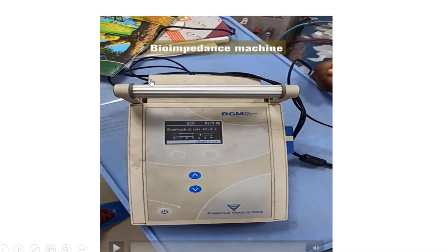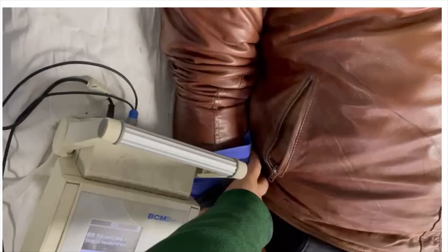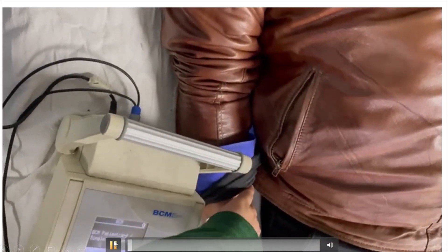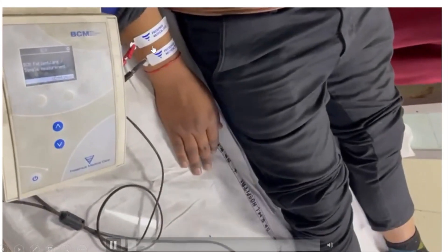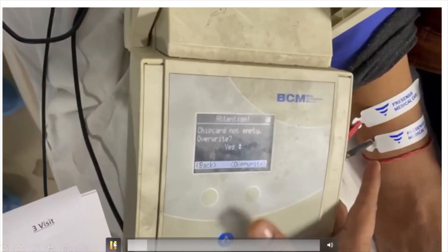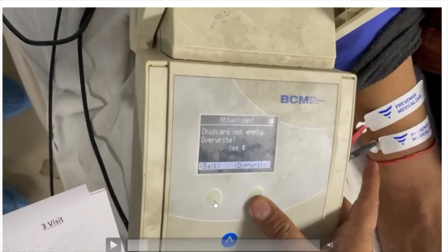Basically, there is one power supply which is connected to the machine. We have to insert a small chip which comes along with the machine, or can be bought separately. After inserting the chip into the machine, there are four electrodes — two are attached to the lower limb and two are attached to the upper limb. After attaching the electrodes, we start entering the parameters using four buttons: one, two, three, and four.